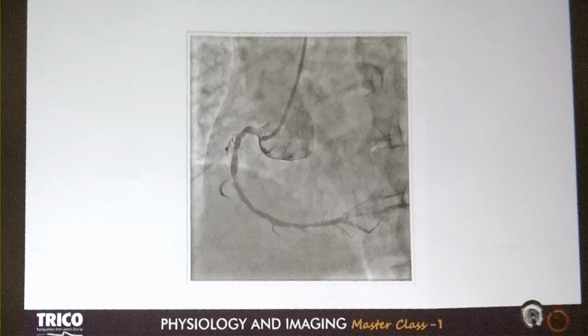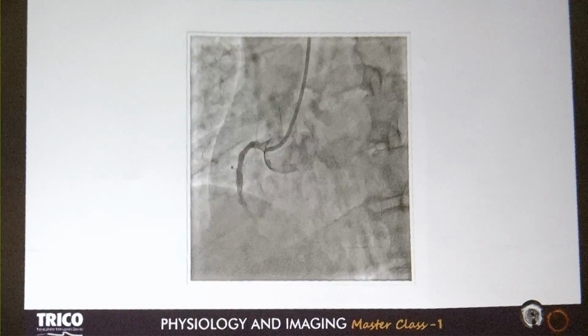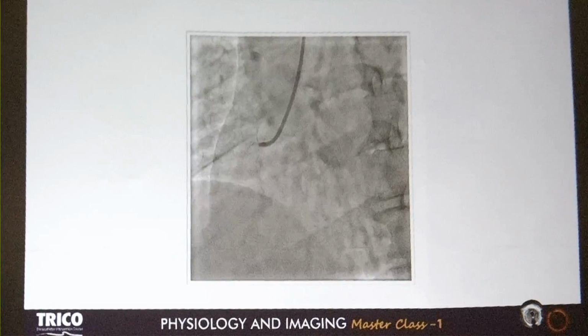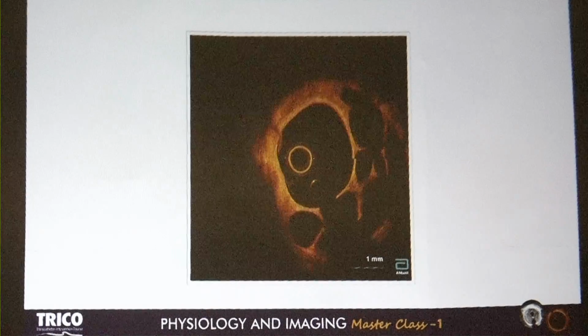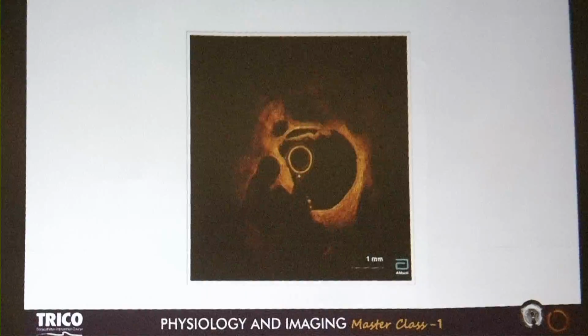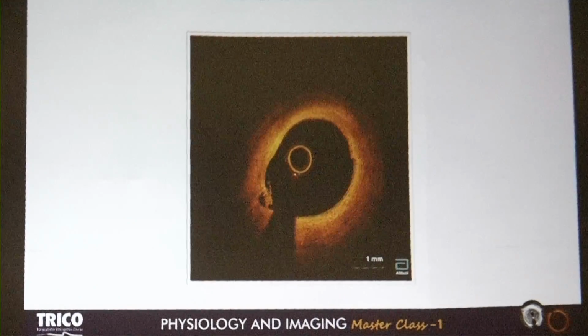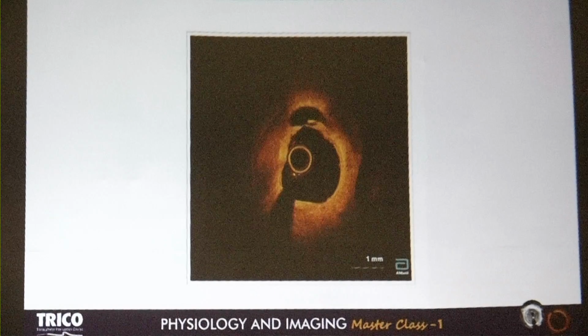Yes, you said it. This is intraarterial collaterals, which intrigued me. And see, this is the appearance after dilatation. I had to go with Pilot 50 and a balloon, and then I dilated. Look at this, it might be recanalized thrombus, right? Honeycomb region, right?